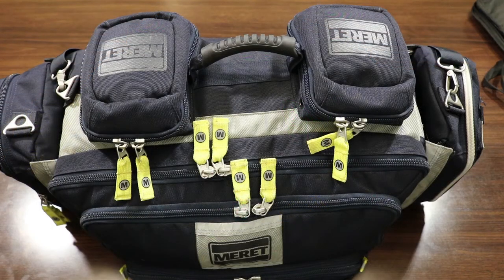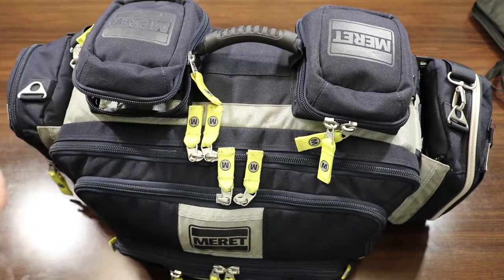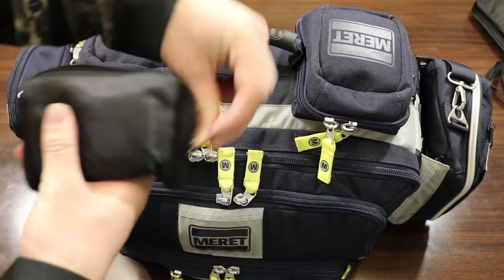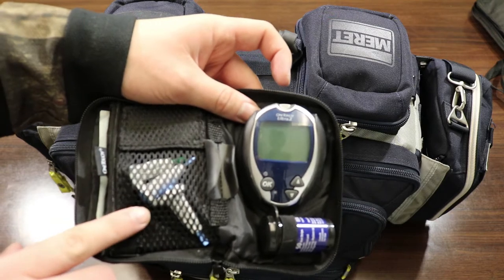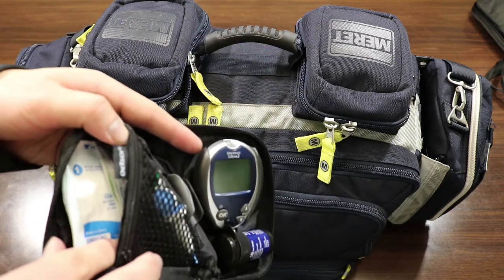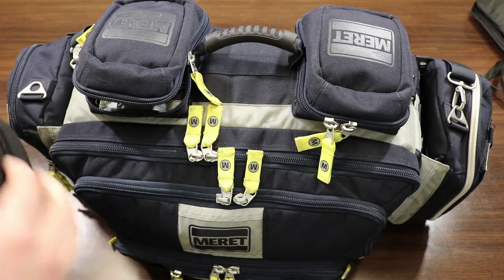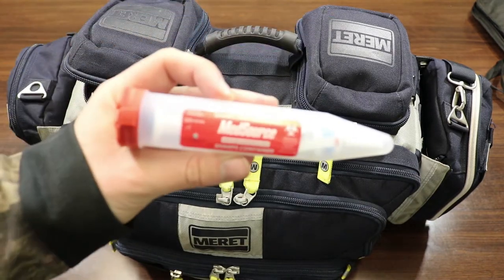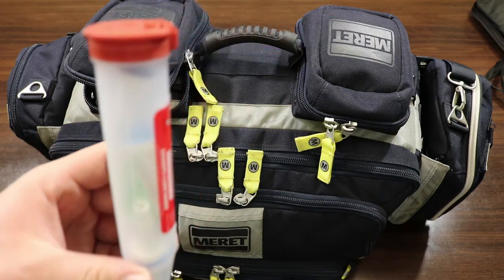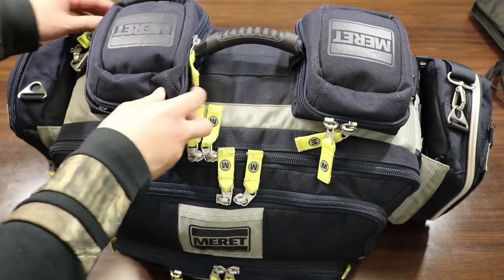Now looking at the front of the bag — in the left pocket we have all of our glucometer supplies. We have a nice black pouch that holds everything: our actual reader, the test strips below that, some lancets, band-aids, alcohol prep pads, and gauze in the back. Also in the bag we have a sharps container. Whenever possible, try to only use this sharps container for lancets so we don't fill it up too quickly.